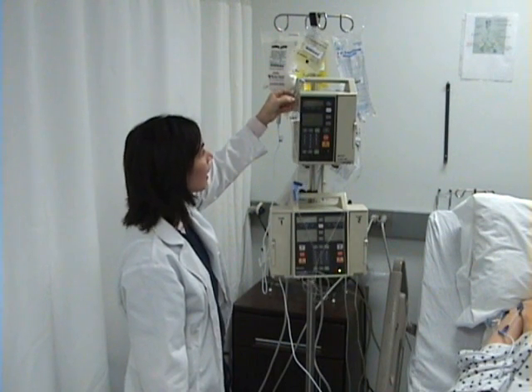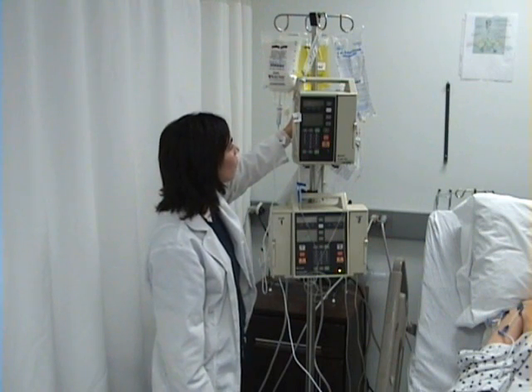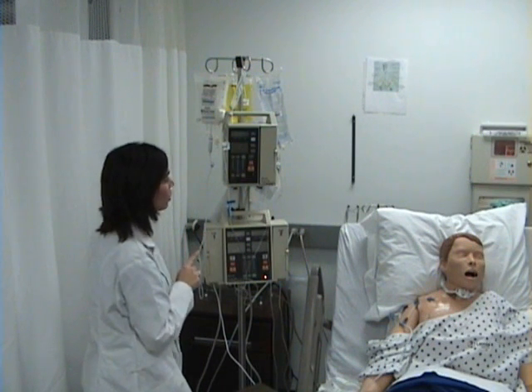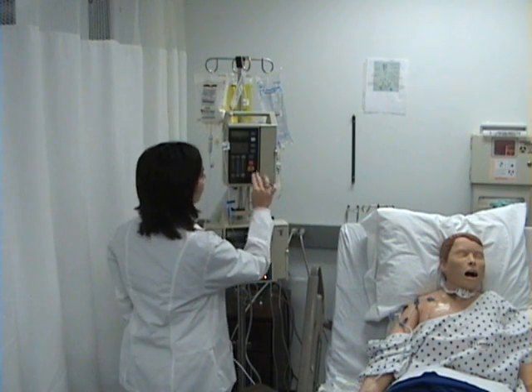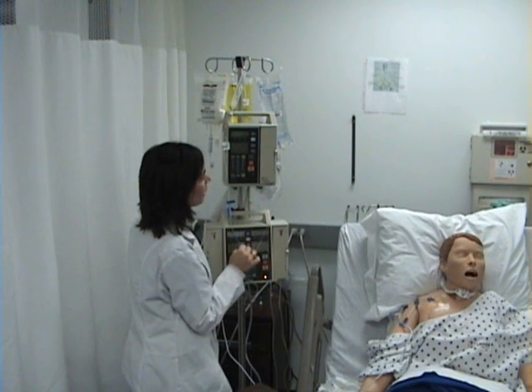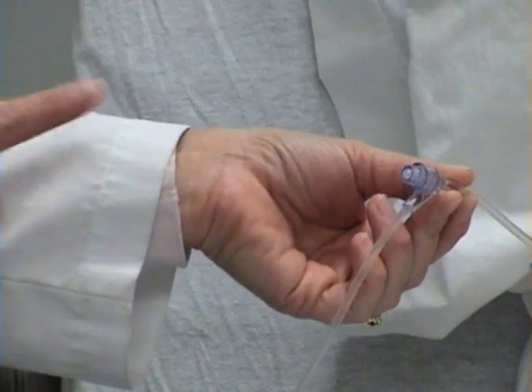Note that while the IV piggyback is infusing, the hyperalimentation and the vitamin B12 continue to infuse. The IV pumps are calibrated so that once the IV piggyback is finished, the pump will switch back to the primary volume and rate of the normal saline. Some institutions have syringe pumps — a syringe filled with medication that will infuse to the patient. The syringe fits into a syringe pump, and the end of the tubing must be connected to the port closest to the patient on a line of compatible fluid.